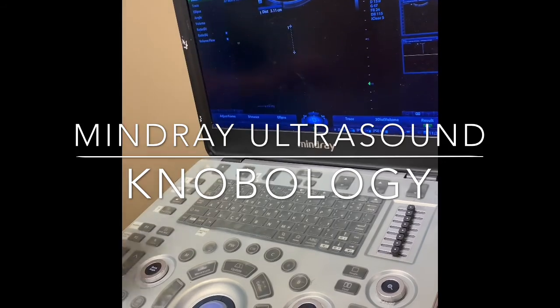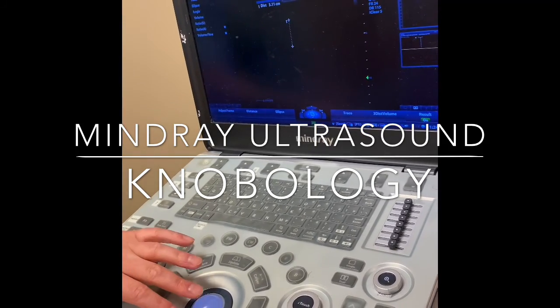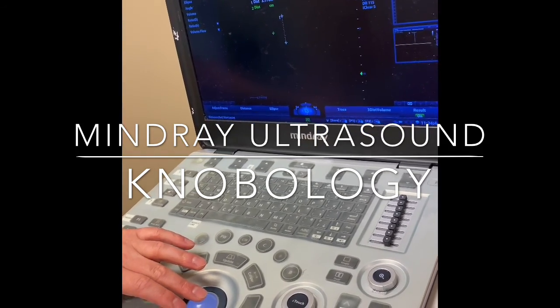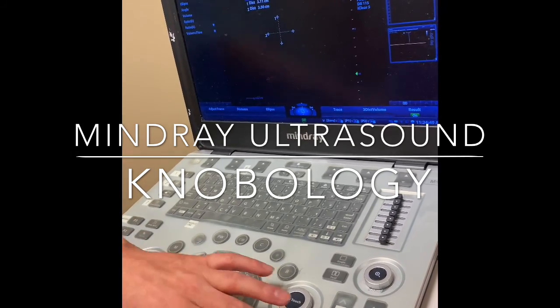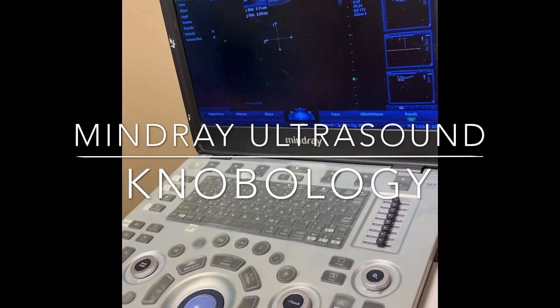Once I have it where I want it, I click again, and I could see that the measurement popped up here. If I want a second measurement, all I have to do is move the trackball and another caliper appears, and I do the same thing. If I want to save that, I press save, still image.